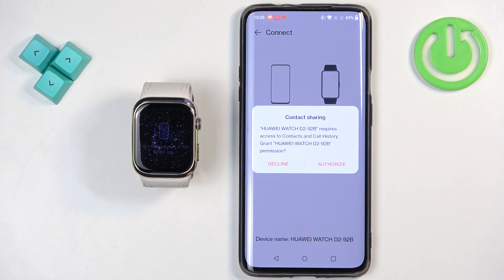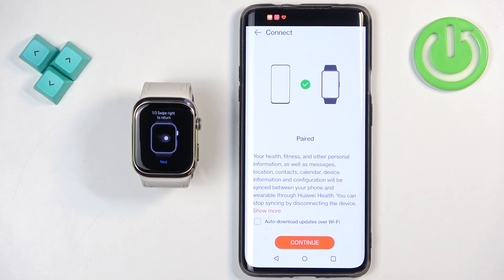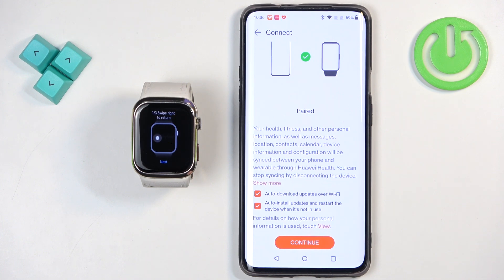You can also authorize sharing contacts — this is useful for calls. Agree to the terms and tap on next. Here you can allow auto updates and auto install for updates. If you check these boxes the updates will automatically install; if you don't care, you can do it manually. Then tap on continue.